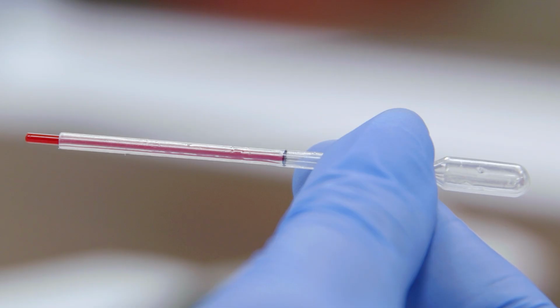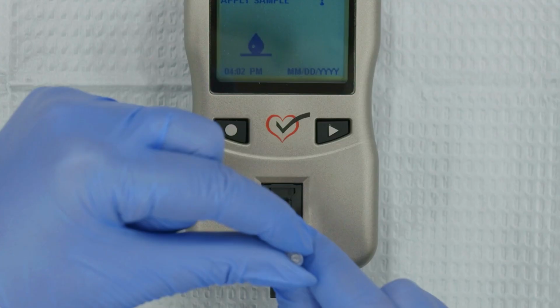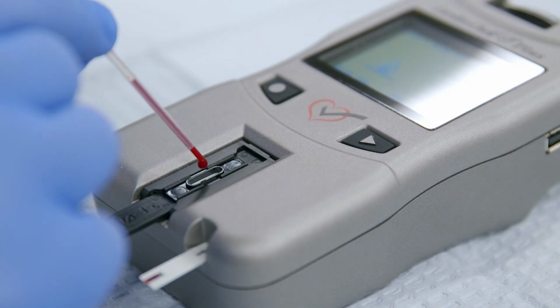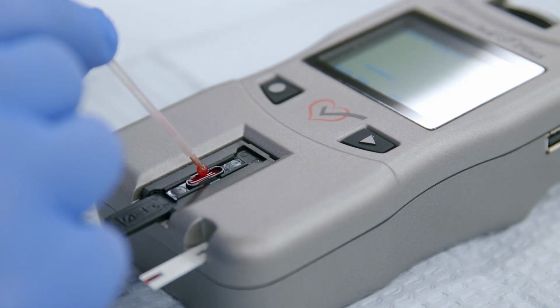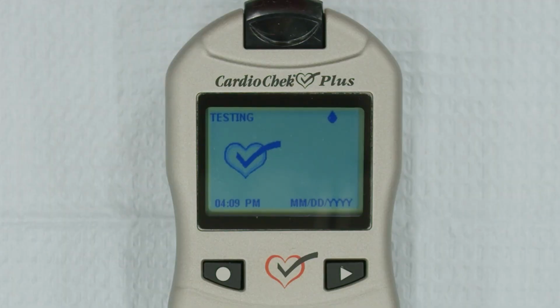To dispense the blood sample, hold the bulb of the capillary tube, placing your fingers over the two small holes. In one gentle, steady squeeze of the bulb, dispense the entire sample onto the strip. Be careful not to touch the tip of the capillary tube to the test strip. Once you've applied the sample, do not move the analyzer until the test is complete. Results will appear on your screen in as little as 90 seconds.